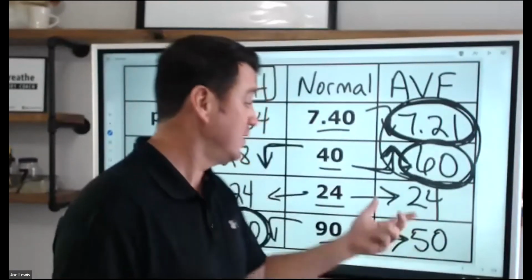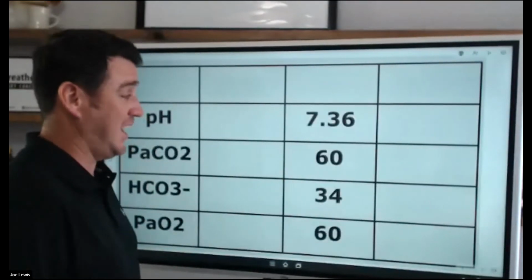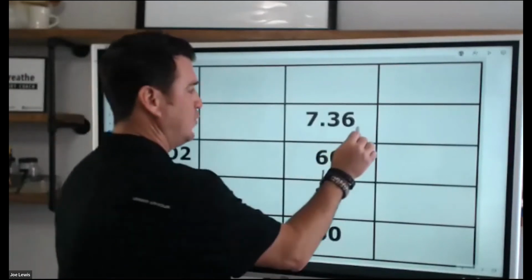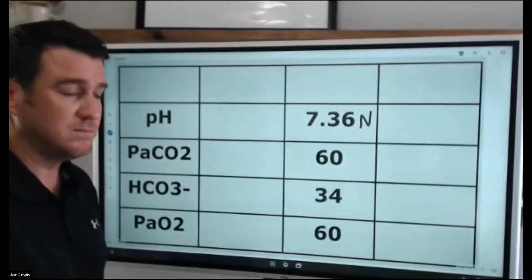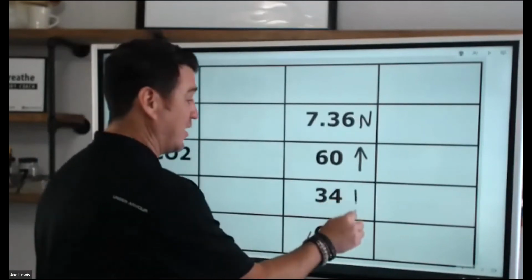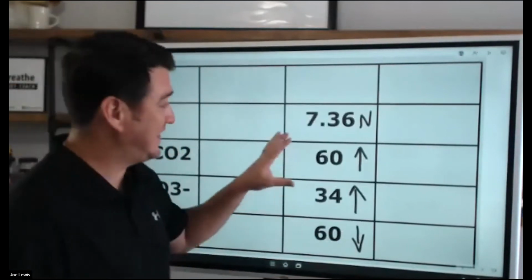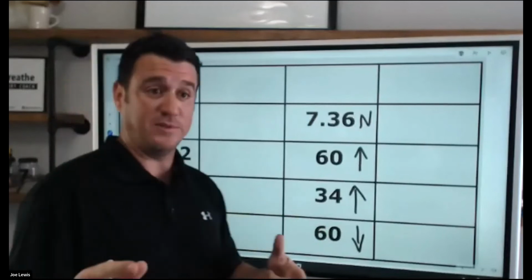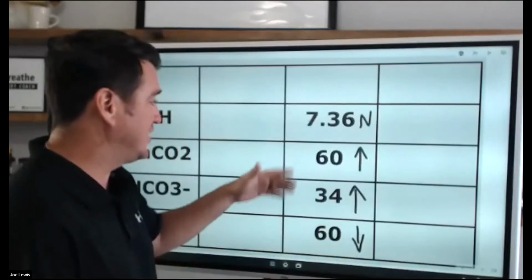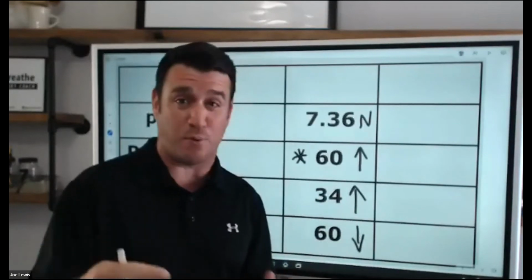That's super important. It's super important to recognize that this pH is acidotic, okay? Because what we're going to see here right now is that we can also have this blood gas, okay? So pH, PCO2, bicarb, PaO2. Let's break this down. Normal pH, okay? High CO2, high bicarb, low PaO2. Now, when we look at this, sometimes, especially students, you want to maybe approach this and go, oh, I'm worried about this CO2 because it's high. You have got to recognize this is not a problem.